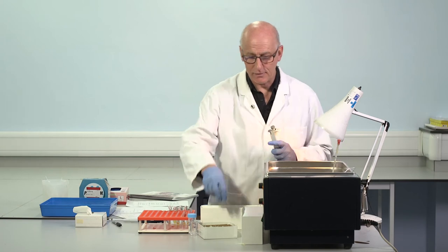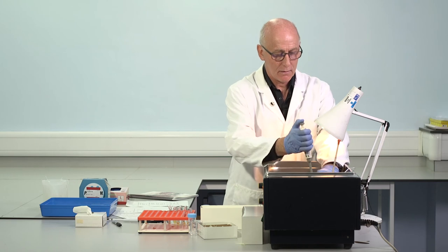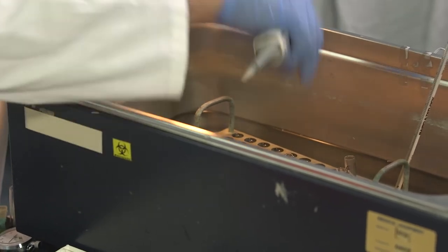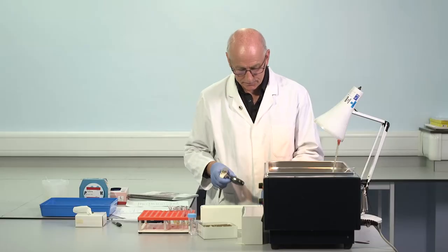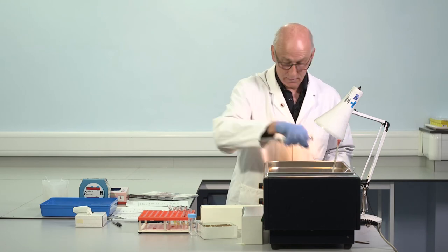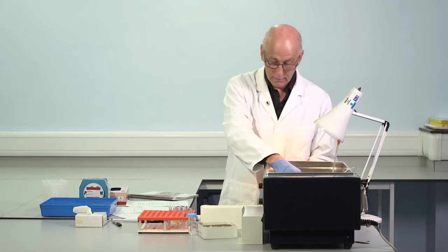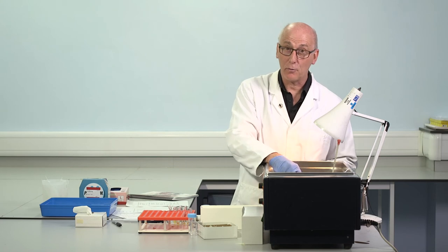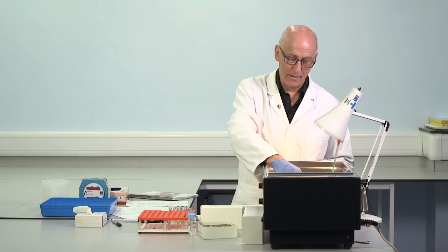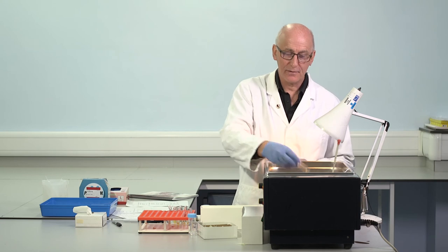Somebody goes to the patient and says, well, you know, there may be a problem. We've got to explain this abnormal APTT before we can be safe to proceed with surgery. And then maybe the operation is cancelled. The patient is subject to anxiety, as you can imagine. There is additional clinical time in further investigations, additional laboratory time, laboratory expense. We do a number of tests, and at the end of that time, we identify, very frequently, the presence of lupus anticoagulant.